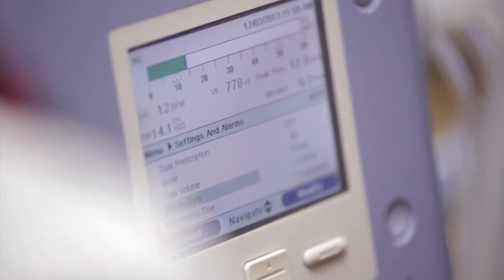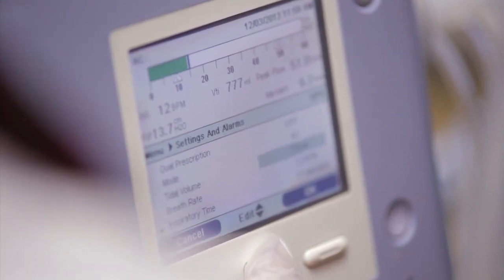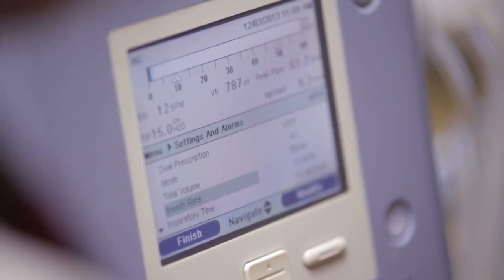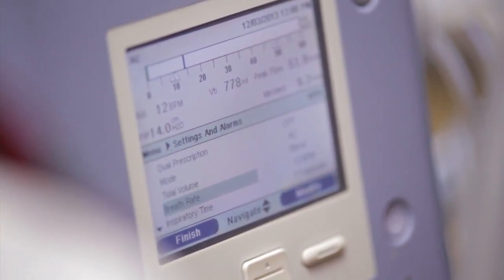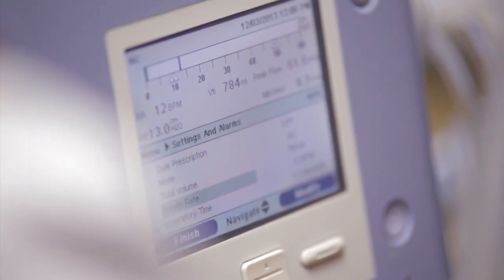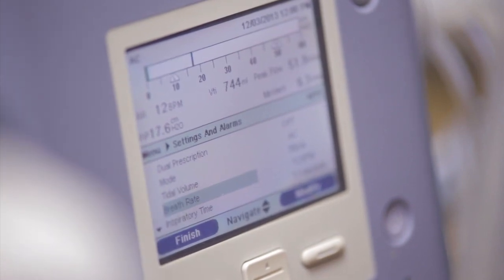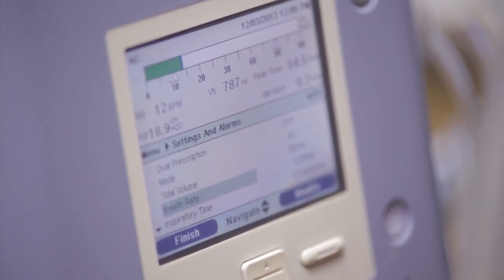Is the air coming out your nose? Possibly. Let's try just a little more — are you willing to increase just a little more? Can you cough for me? With your cough it went up — we're sitting at 15, now 15.5. That's close, within half a centimeter of water pressure. Would it go up with eating and swallowing as well? Yes, it would. In fact, while you're talking it's actually going up some, because you're creating a back pressure and the ventilator is reading that pressure as well.